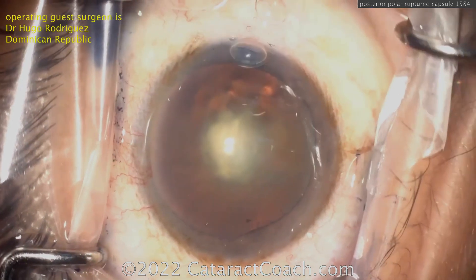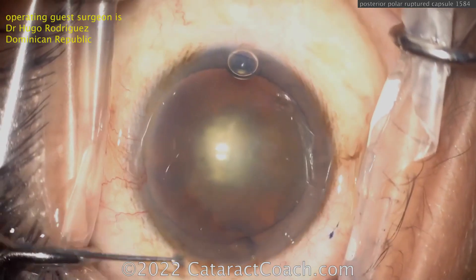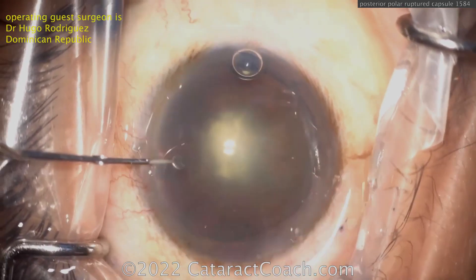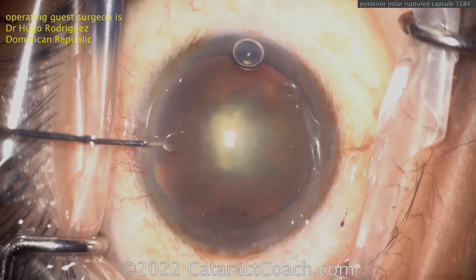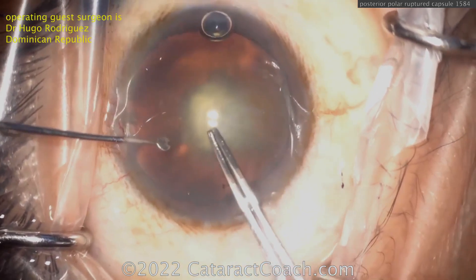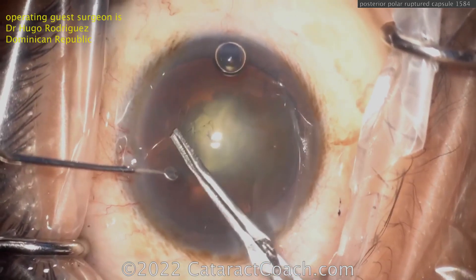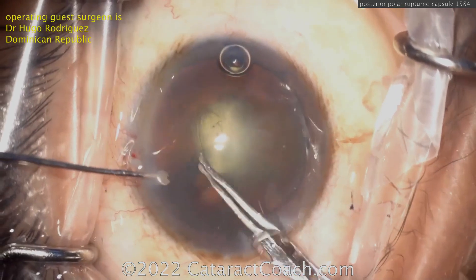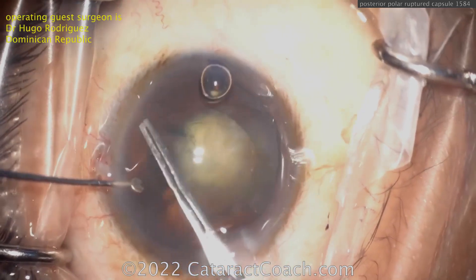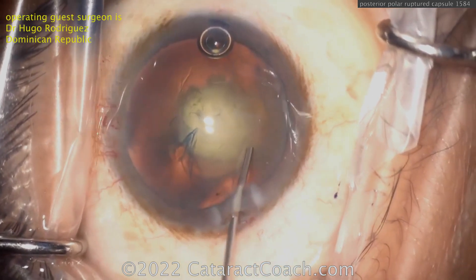There are ways we can help combat that and lower the risk, like doing our viscodissection technique. But keep in mind, it's still patient protoplasm — meaning it still depends on the patient. Some patients you can be very rough in the eye, relatively speaking, and the capsule stays intact. In other eyes, you can do everything beautifully with the proper technique, the newest methods, and viscodissection, and still the posterior capsule can open right up. That's a known issue and varies by patient.